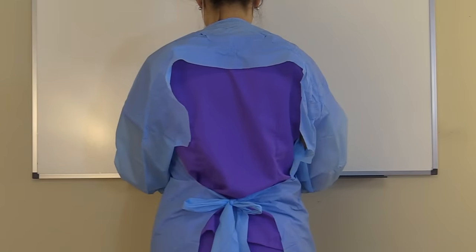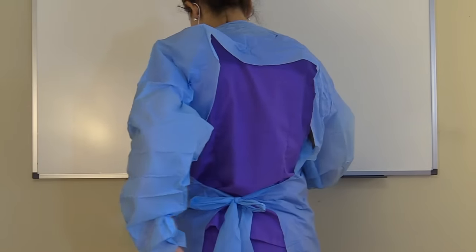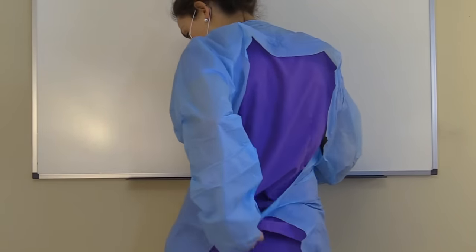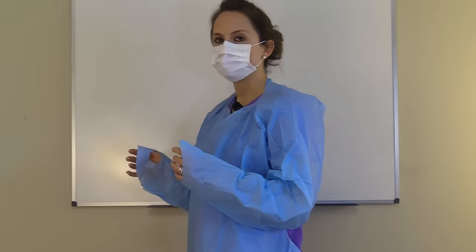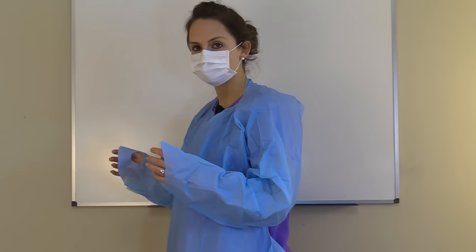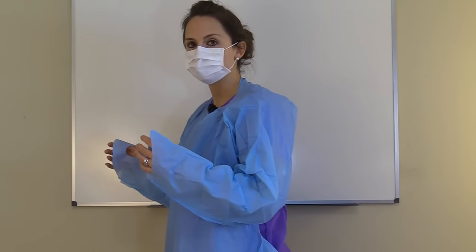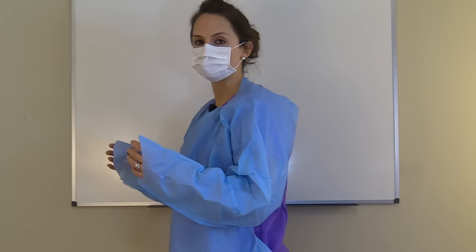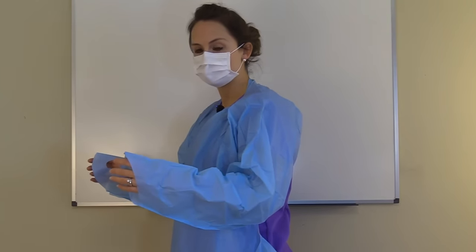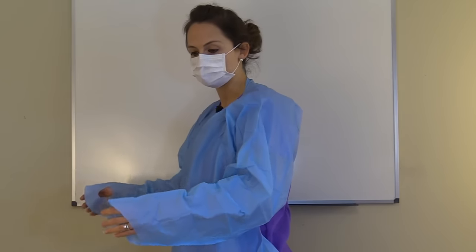Now we are going to remove the gown. Remember, the back of the gown and the ties are clean. So we are going to untie the gown, then remove it from the inside out — slide our arms up through the sleeves and pull the gown from the neck and the shoulders. We want to be careful not to touch the outside of the gown because it is contaminated. Roll the gown into a bundle and then discard.